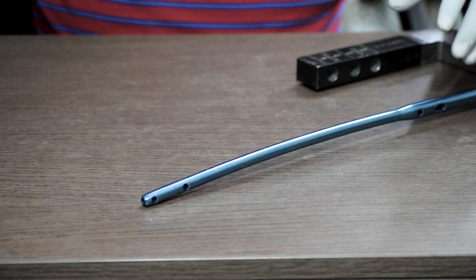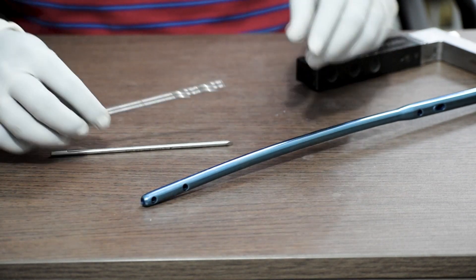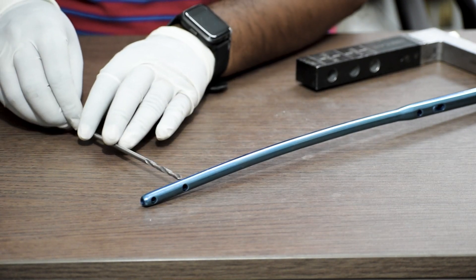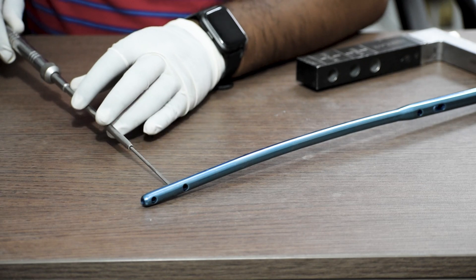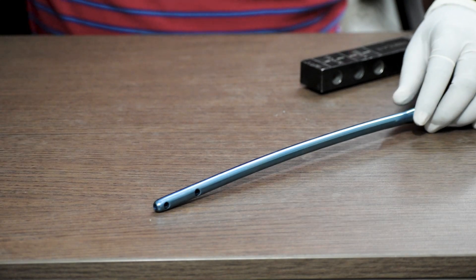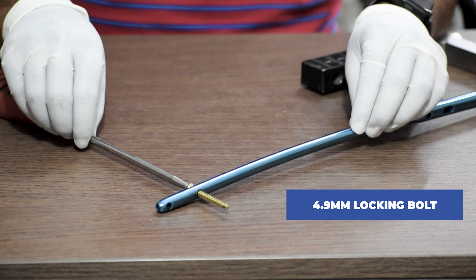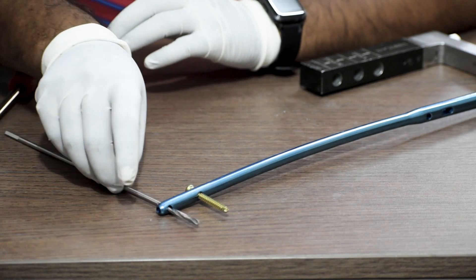After this, we will first lock the distal end of the nail. We can either use a 4 mm stainless pin or a 4 mm drill bit — either one depending on the surgeon's preference. We directly drill through the hole, then take the measurement with the depth gauge. Then we take a 4.5 mm solid screwdriver — 150 mm short one — and fix the 4.9 mm locking bolt of the measured length to lock the distal end of the nail. We repeat the same process for the other hole as well.